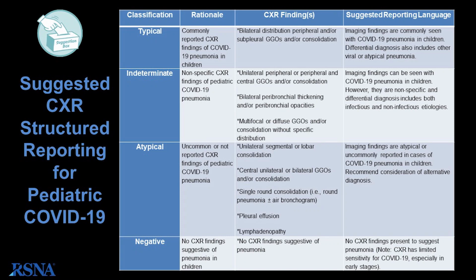The atypical category is where the radiologist can add, I think, more value. This category is where we would report findings that are atypical for COVID-19, and we should recommend to our referring providers that they may need to consider alternative diagnoses.